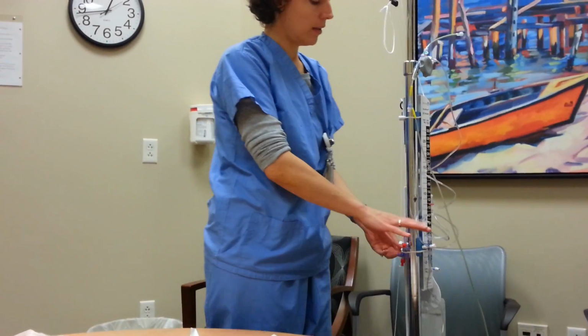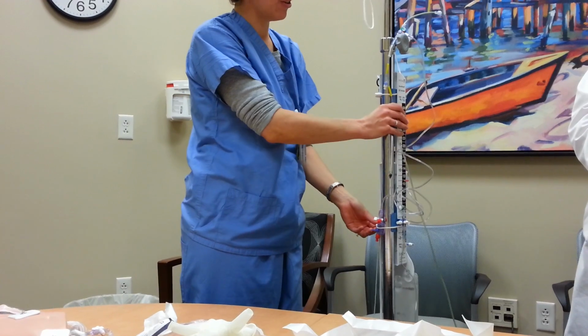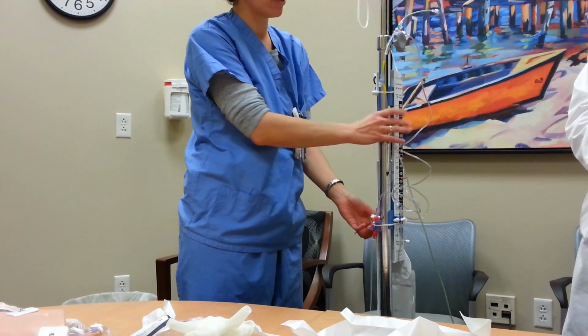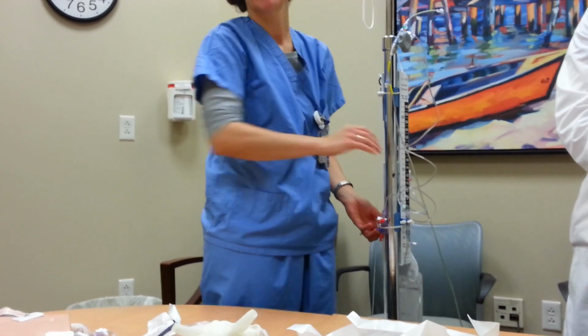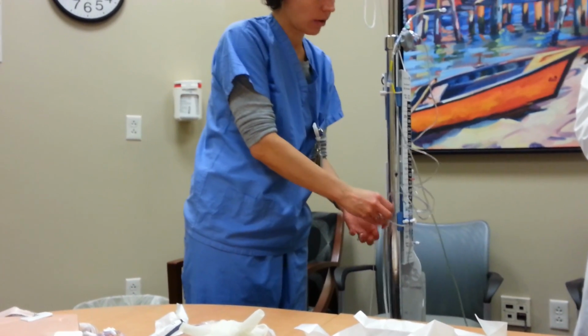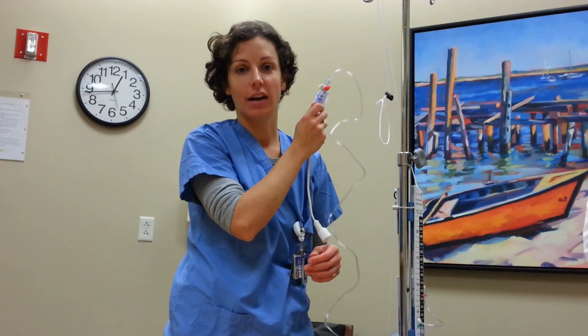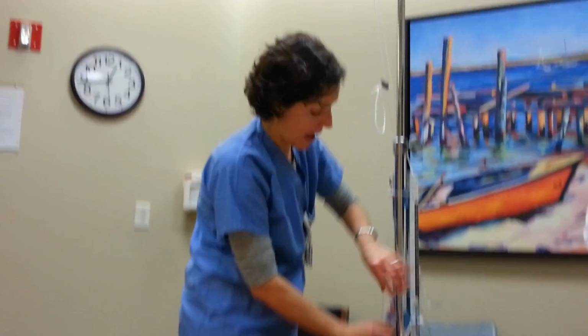Sure. If you're transporting, the patient's been moved, you may not have the burette level at the right time. But let's say you want to quickly get an accurate ICP, it's totally okay to take the transducer off and put it next to the patient's head. That will quickly give you an accurate ICP, and then you can put it back.